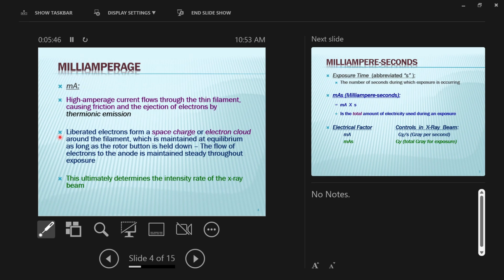you know if you've been in the X-ray rooms at all, there's two buttons, right? Prep and expose. The prep button spins the rotor, right? And on the other side, the cathode side, it builds a charge in the filament, okay? You notice that if you've done this, you have to wait, right? It doesn't happen immediately. Some newer systems are very quick. You press the prep and immediately it's up to speed and ready to expose. But most of the time, like here, you have to prep 1-2 seconds and you hear a beep or a click, right?